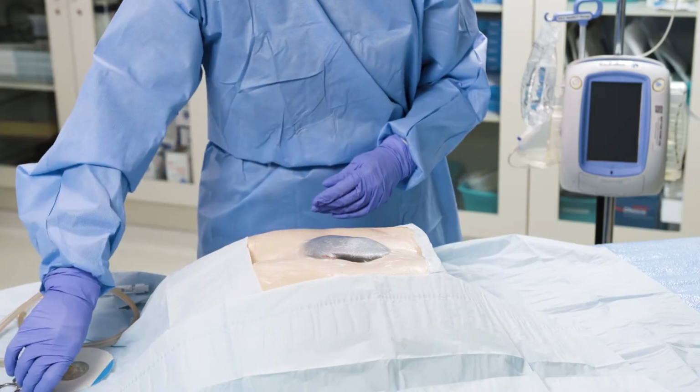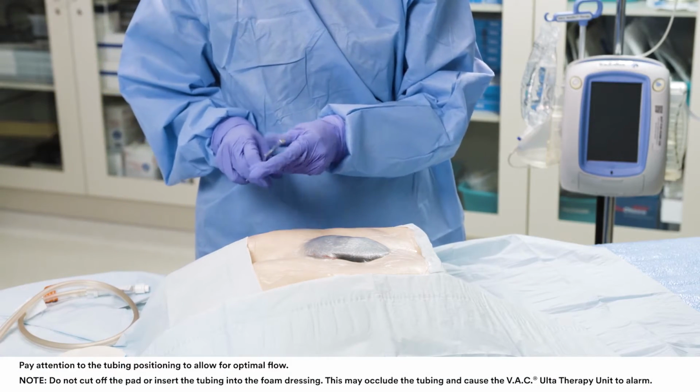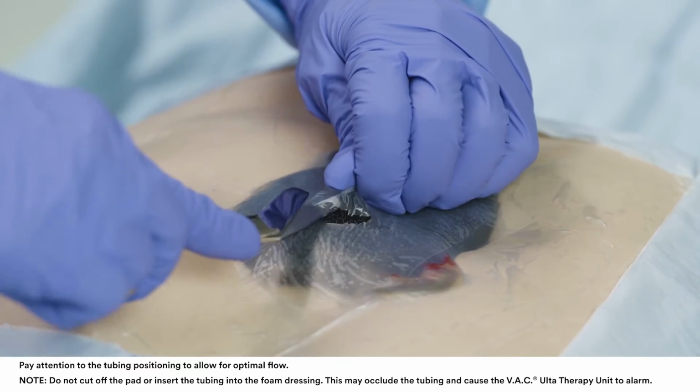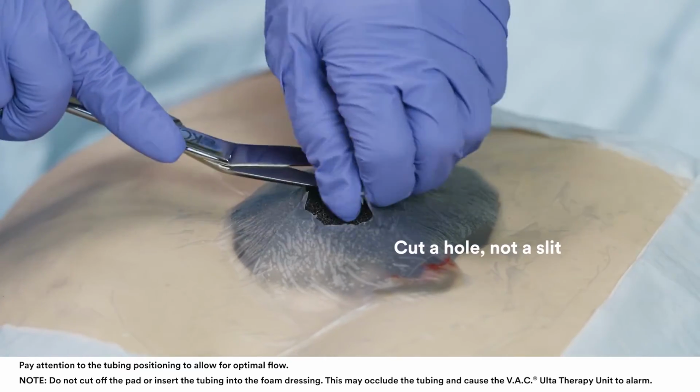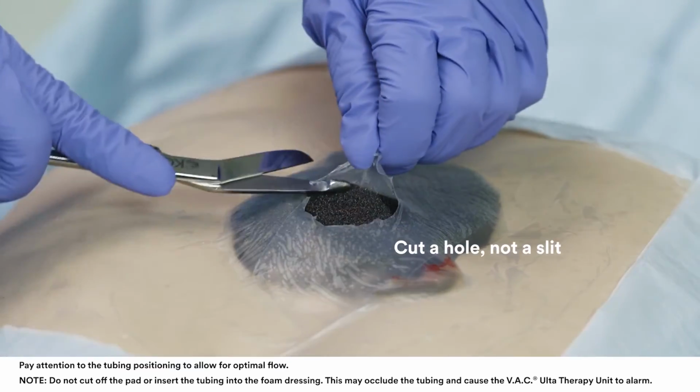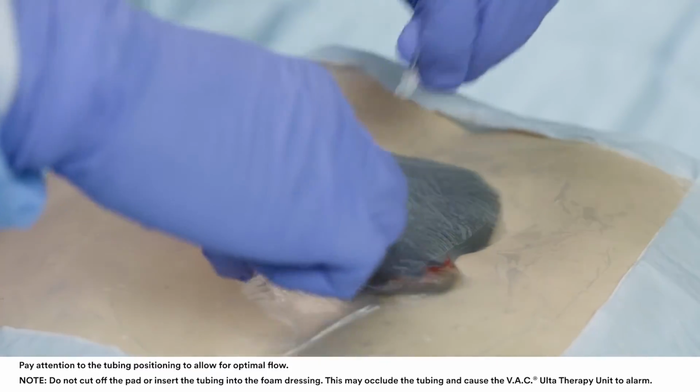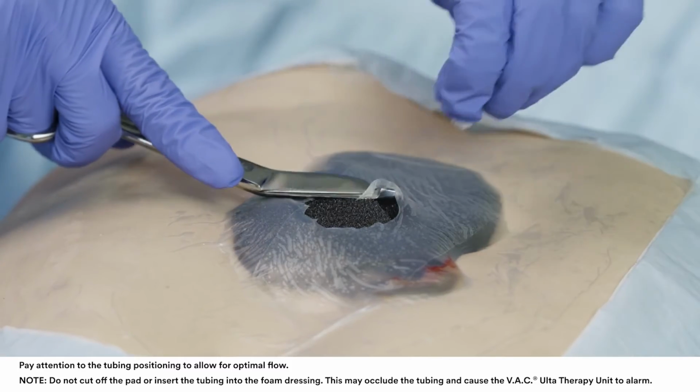Choose an appropriate location for the V.A.C VeraT.R.A.C pad. Pinch the V.A.C Advanced Drape and carefully cut a 2.5 cm hole, not a slit, through it. The hole should be large enough to allow for removal of fluid and exudate. You do not need to cut into the foam.